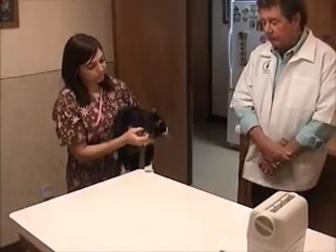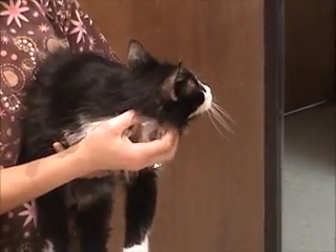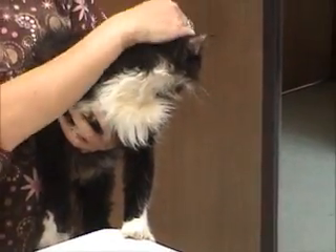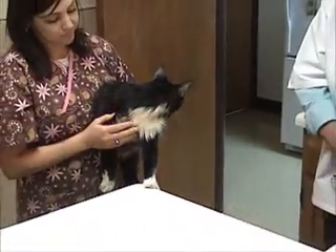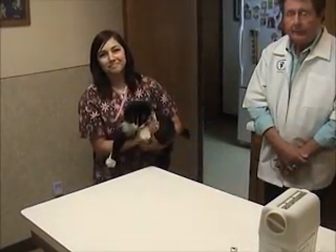We are going to demonstrate how easy it is to deliver insulin. This is Sweetie, one of our clinic cats. She's quite elderly and she has been a diagnosed diabetic for almost a year now. Fortunately, we've been able to control her pretty well. Her symptoms have largely subsided and she's a very happy kitty.